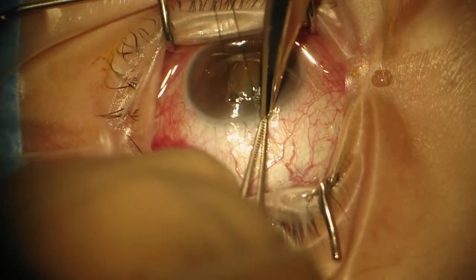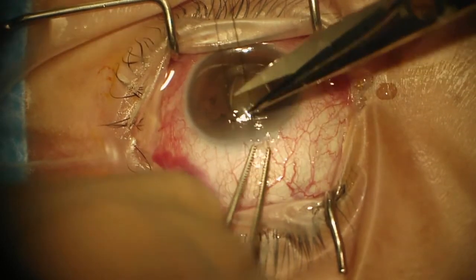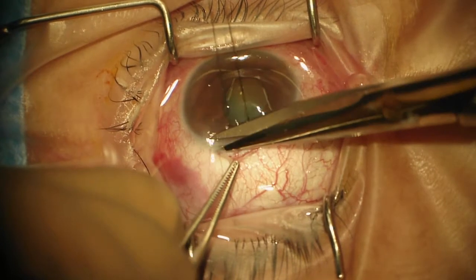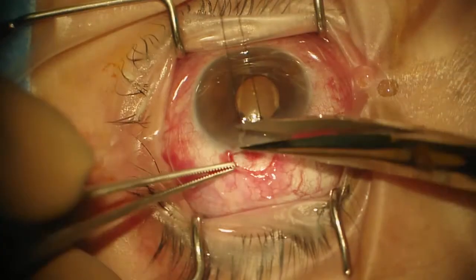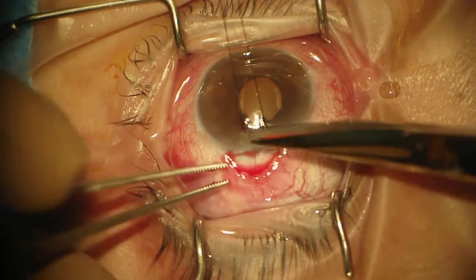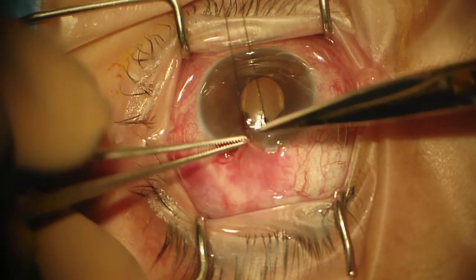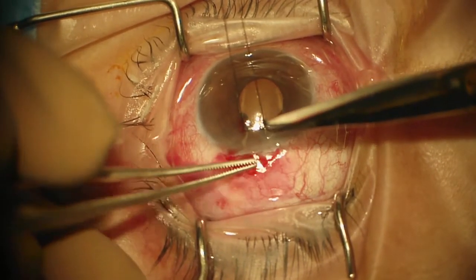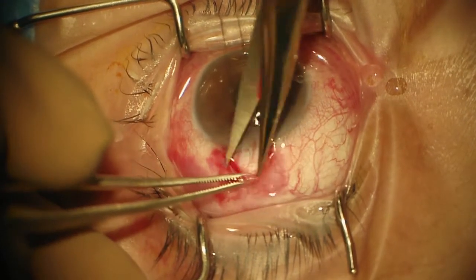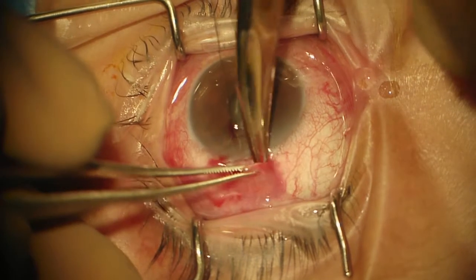We're going to make our peritomy. If you are doing mitomycin with sponges, you have to open up a wider area. The Tenon's inserts a millimeter to two millimeters behind the conjunctiva, so I want to make sure I have that cleared off and I have nice loose conjunctiva so we don't have to dissect back too much.